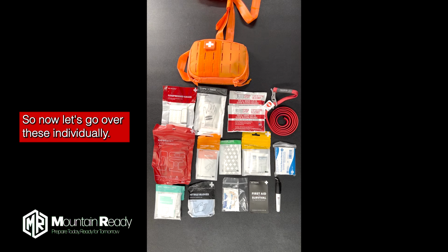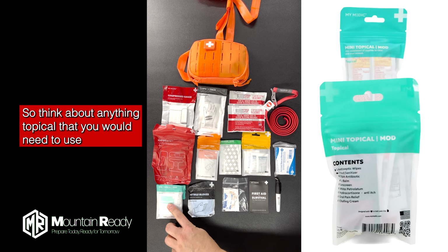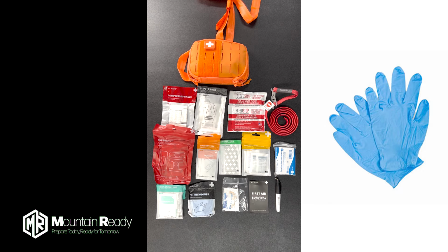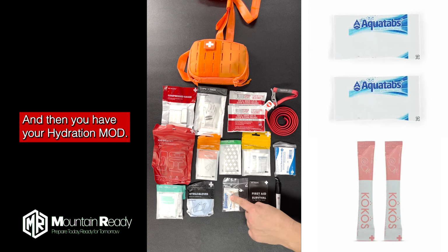So now let's go over these individually. So first of all, this is your topical mod, okay? So think about anything topical that you would need to use. Sunscreen, lip balm, triple antibiotic ointment, hydrocortisone cream, hand sanitizer, all that kind of stuff would be in this guy, okay? Obviously, you have some gloves here, okay? And then you have your hydration mod, right?